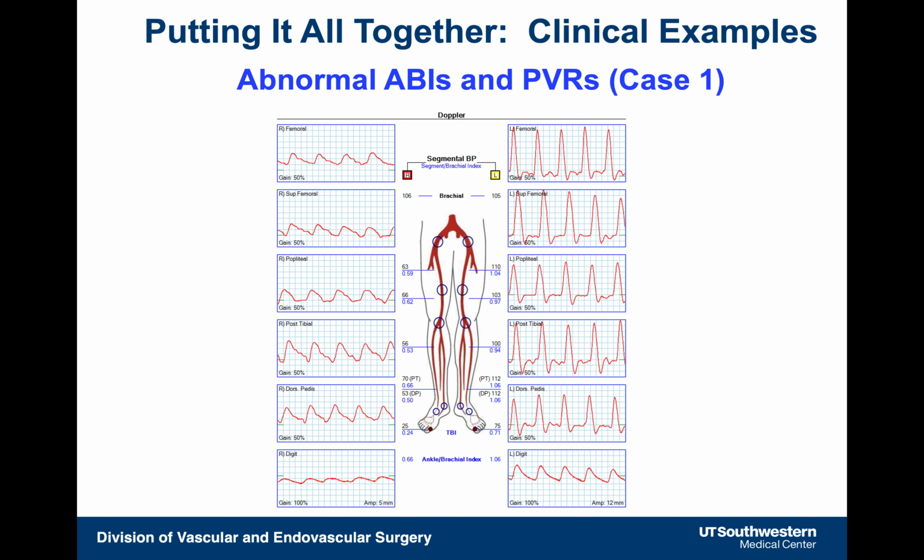Okay, now this is an abnormal test. So we're going to go down here, and as I said, I always look at ankle brachial indices first.